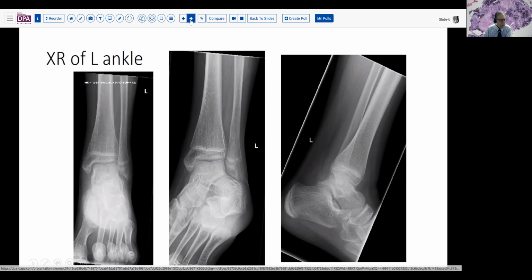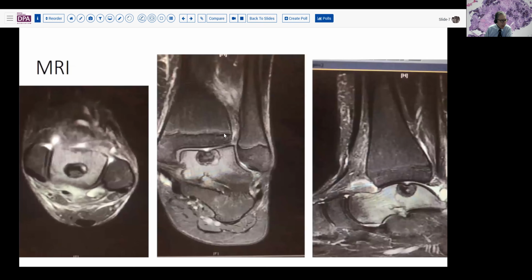Following up on that, some additional MRI studies were done, which also showed this lesion to be centered here, just immediately below the articular cartilage, with a rim of sclerotic bony type tissue, and then a central variegated pattern, as you can see on all of these images here.